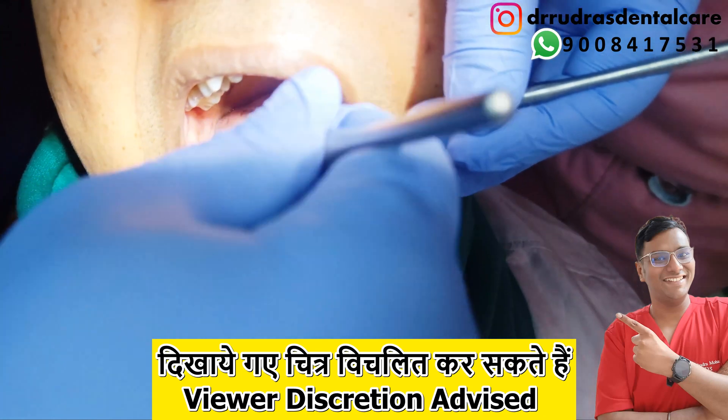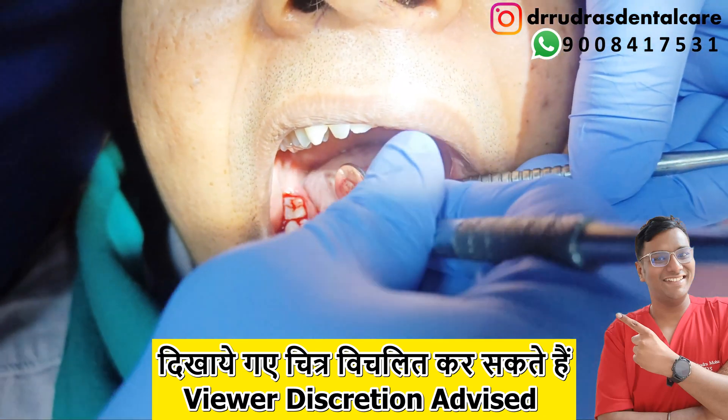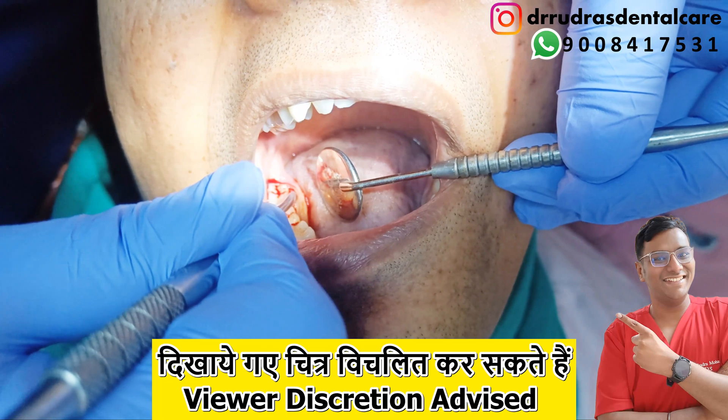The alveoloplasty procedure is carried out under local anesthesia to ensure smoothening of the bony spicules that are present as rough surfaces on the jawbone, as a pre-prosthetic procedure.